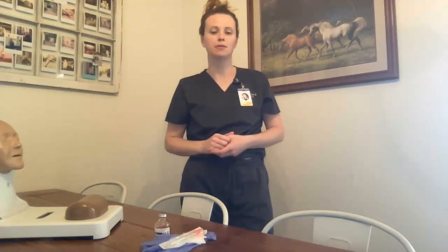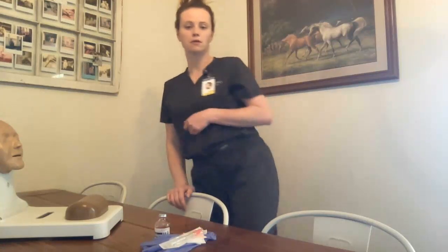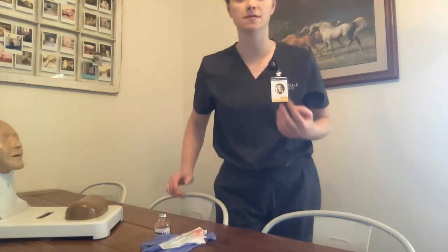Hi, my name is Emily. I'm going to be performing a skill administration of intradermal injections. I am in the appropriate school attire. I am wearing shoes, my badge is visible, no polish, no acrylic nails, no jewelry.